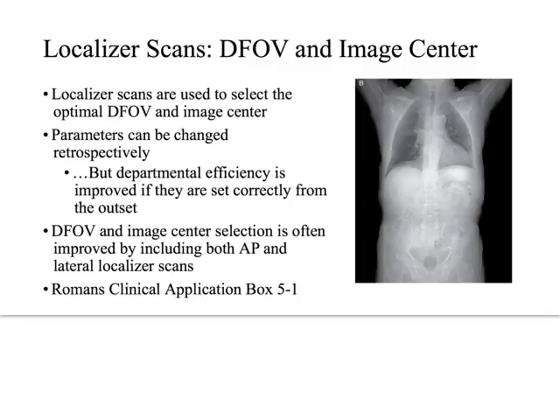So it's moved the table through the gantry without moving the tube. So I got something that looks like it almost looks like an X-ray, right? It looks a lot like an X-ray of the person's chest, abdomen, pelvis. And I can even use it to a limited diagnostic sense. Like doctors will use this to facilitate diagnosis, this localizer image. So there's a lot embedded in it.